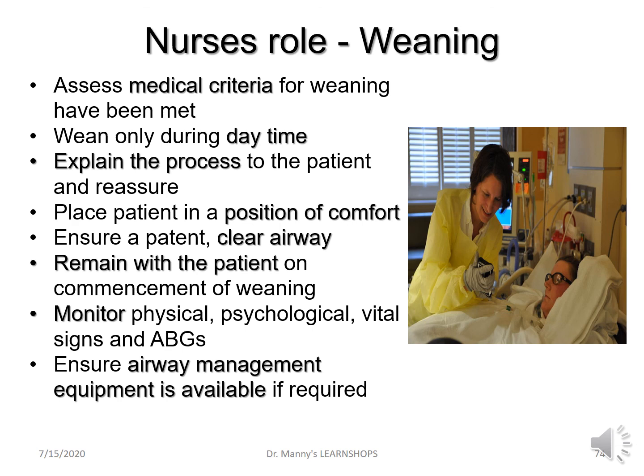Ensure that the patient's airway is clear and always remain with the patient on the commencement of the weaning process. You're a patient advocate. They want to feel confident and secured. Monitor the physical, psychological and vital signs, and especially their arterial blood gases. And ensure that the airway management equipment, resuscitation equipment, is always available and relevant for that patient.